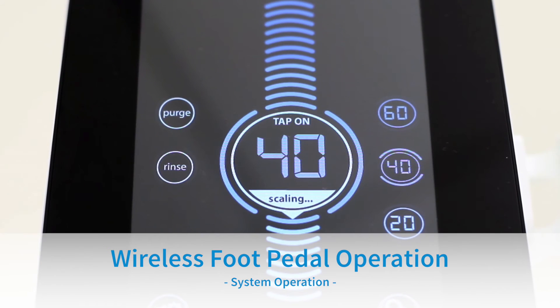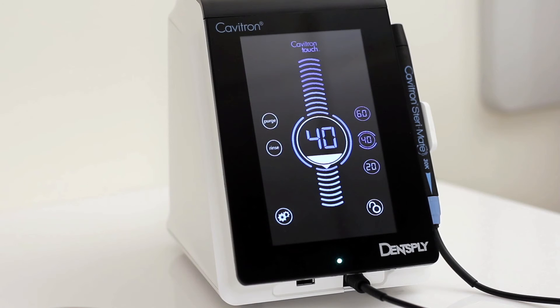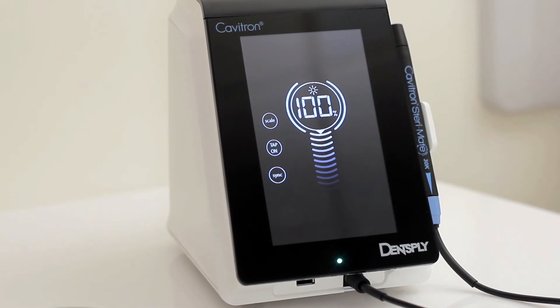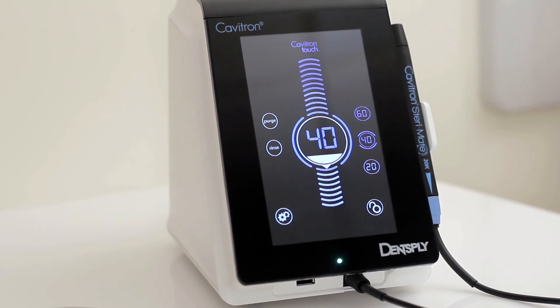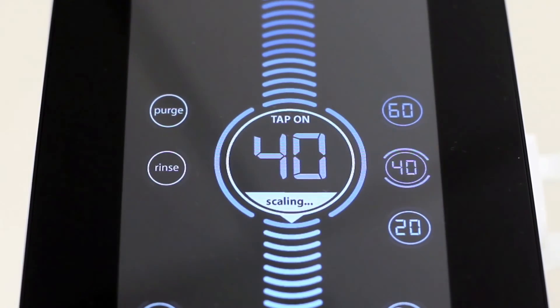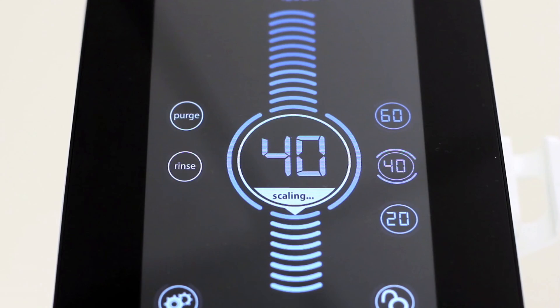Tap-On Wireless Rechargeable Foot Pedal Operation: This feature eliminates the need to hold down or pump the foot pedal, adding comfort to your routine. Enter the settings screen to enable or disable tap-on. When parentheses are shown around the tap-on icon, tap-on is activated. If there are no parentheses visible, tap-on is deactivated and the icon will be grayed out. With tap-on activated, tapping the foot pedal once will activate ultrasonic power for approximately 4 minutes. Tapping the foot pedal a second time will disable ultrasonic power and water flow. On the main scaling screen, a tap-on indicator will appear in the power level bubble while scaling.